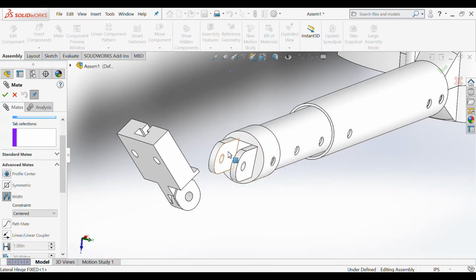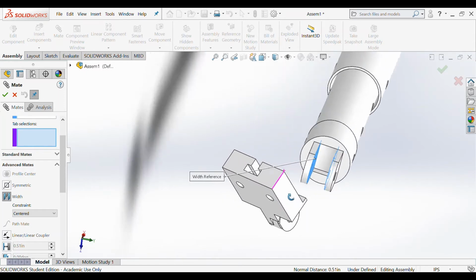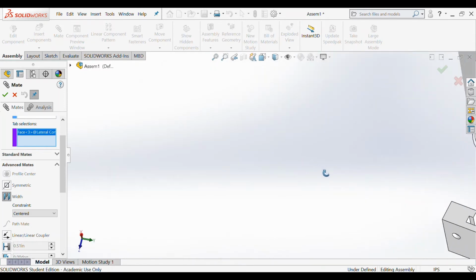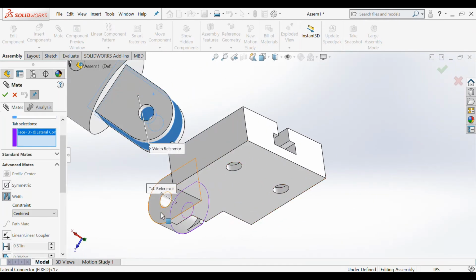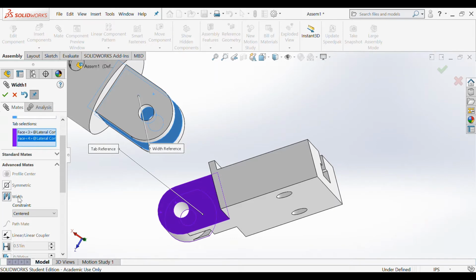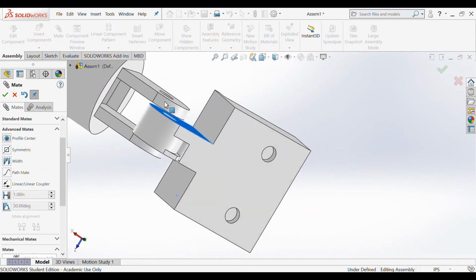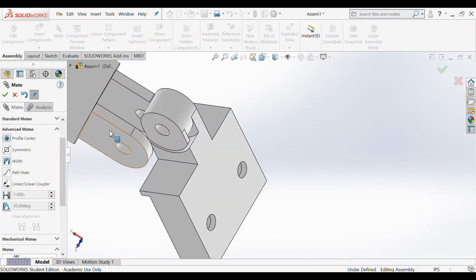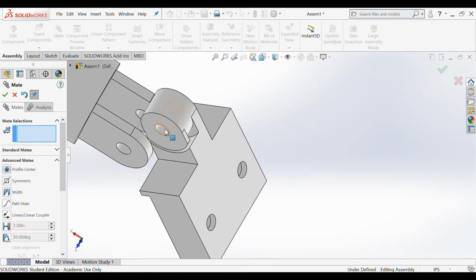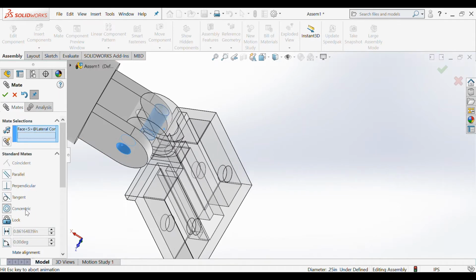So I'm going to choose the outer two surfaces and then the inner two surfaces. As a width mate, I'm going to click that check mark. And then we're going to click on the inner holes under our standard mate and make them concentric.